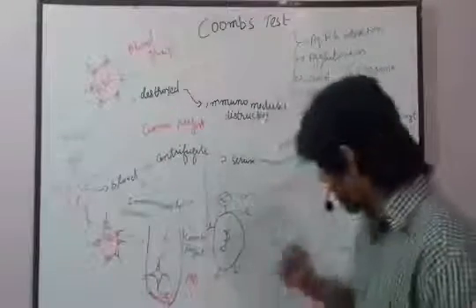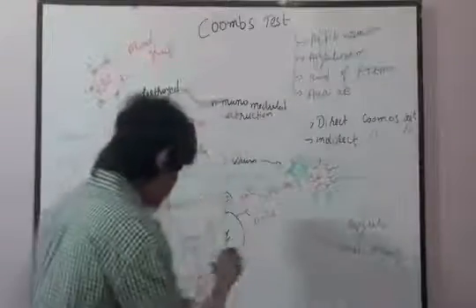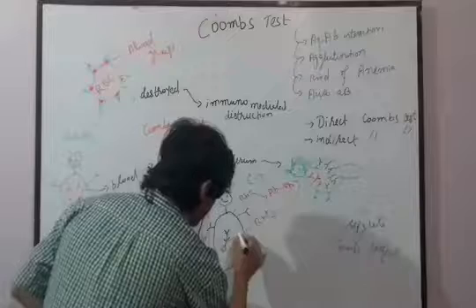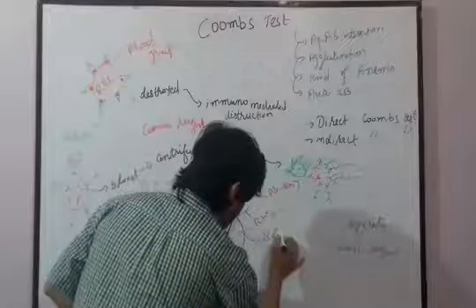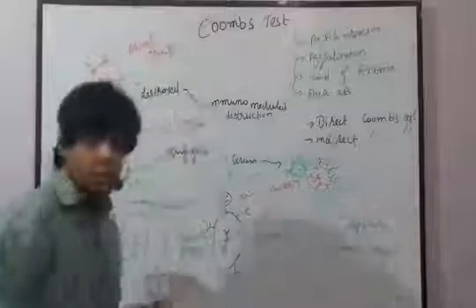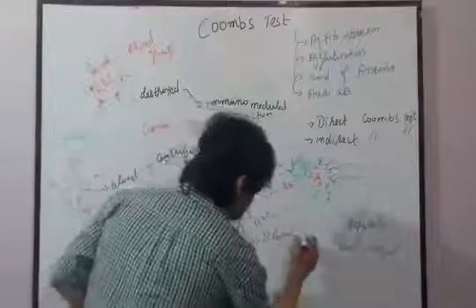Fine. So how can we perform this test? We can perform this test simply. We take the blood sample from the patient. Once we take the blood sample, then we centrifuge it.